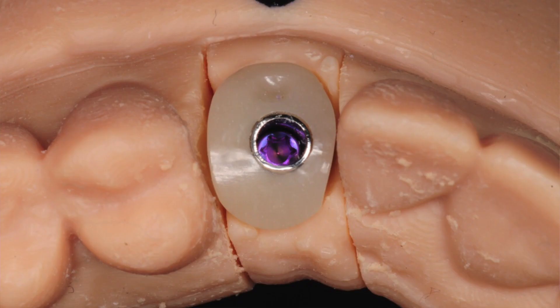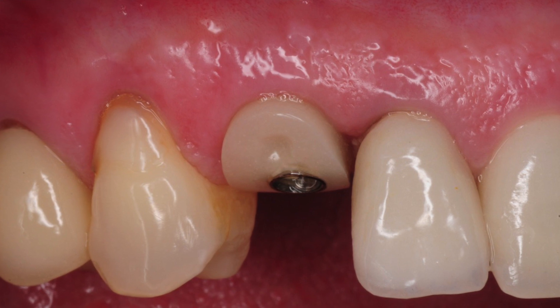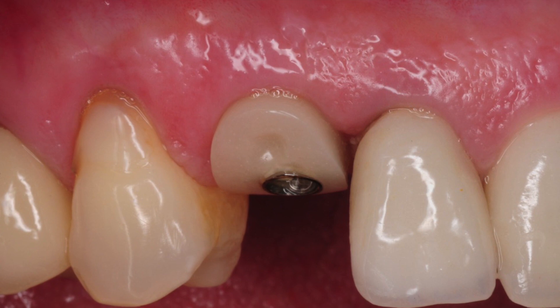The second type is a customized healing abutment, which is made of a titanium base and usually some sort of polymer-like material where it transitions through the gum tissue. This is designed and fabricated by the laboratory in order to guide the gum tissue during healing to achieve a better simulation of the natural tooth. It's often used in the smile zone, but can certainly be used on any implant to create a more natural gum tissue shape and appearance.